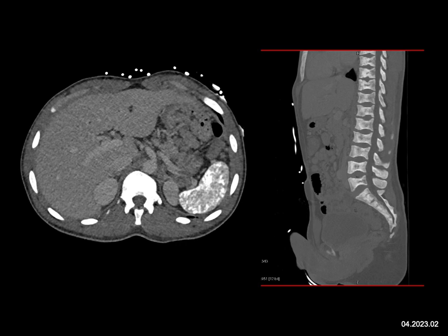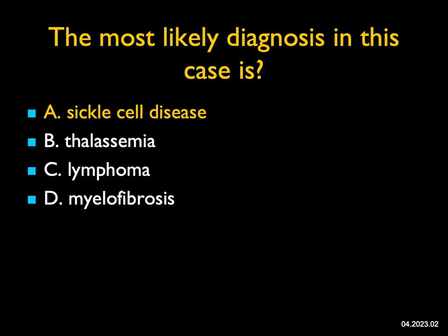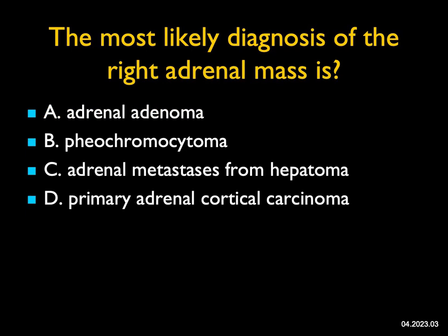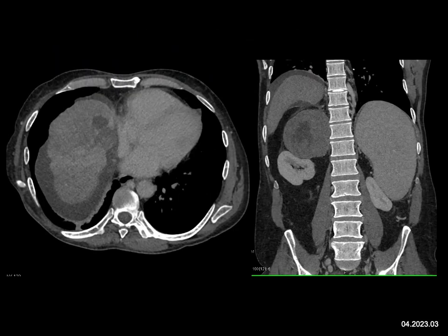We used to see dense spleens in patients who received Thorotrast but we don't see that anymore. On the sagittal view of the spine you have the classic fish-mouth vertebral body. It's not thalassemia, which gives a big spleen, not lymphoma, and not myelofibrosis, which typically has a large spleen. Between the spleen and spine findings, this is a classic example of sickle cell disease.